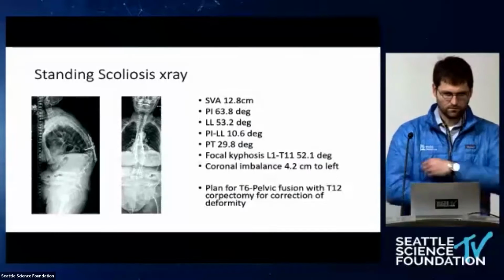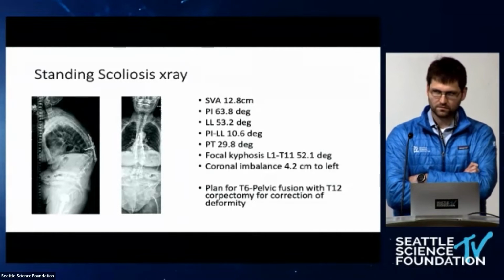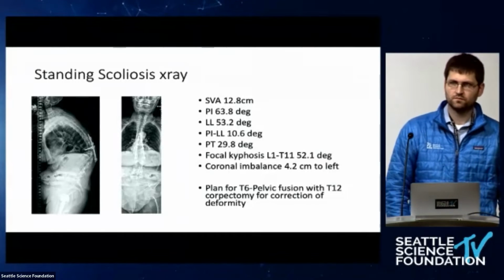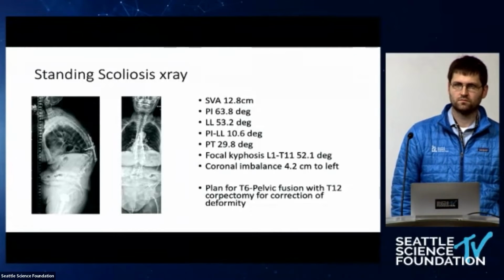This is a year out and everything had healed, but she was progressively more kyphotic. You could really palpate the hardware underneath the skin. What do you guys think, Dr. Martin?